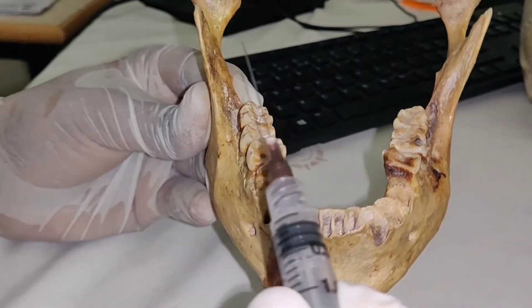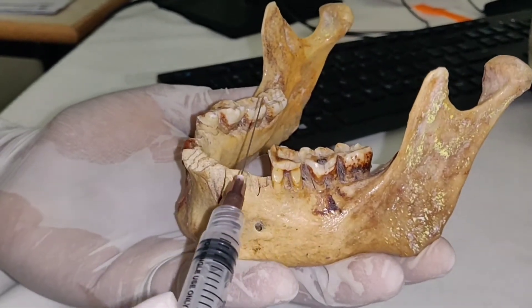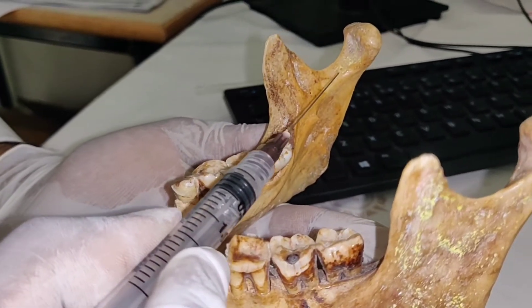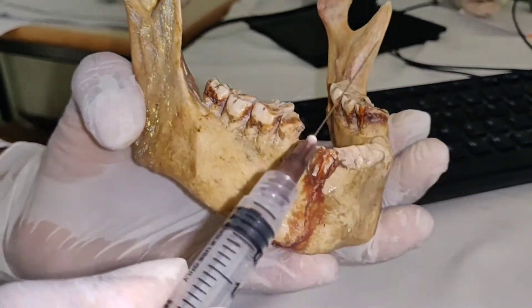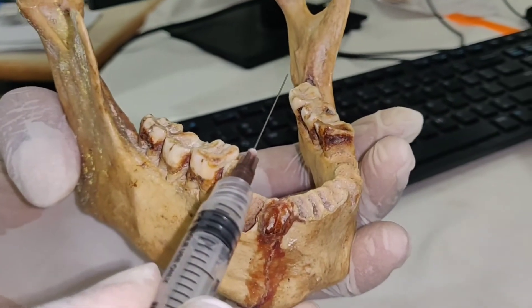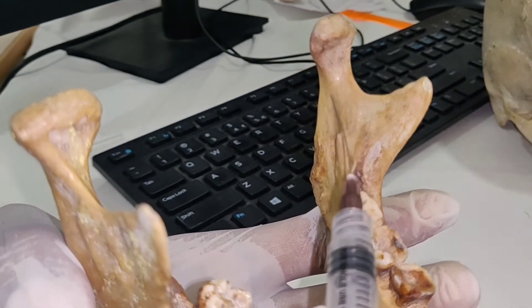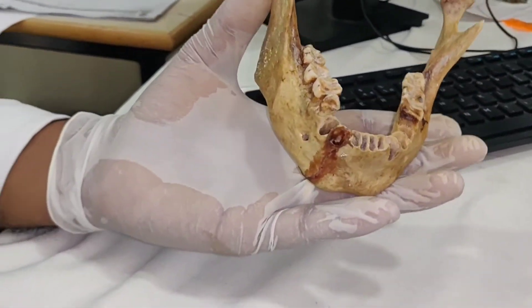For the procedure, place the syringe between the first and the second premolar and go straight. Once you hit the bone, retract the needle and check for positive aspiration. If aspiration is negative, deposit the local anesthesia. That's the inferior alveolar nerve block.